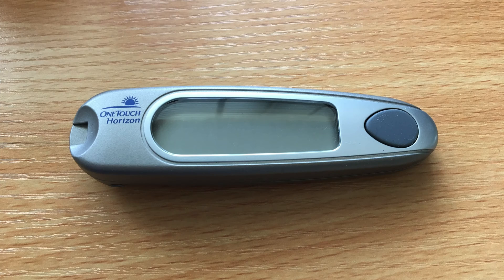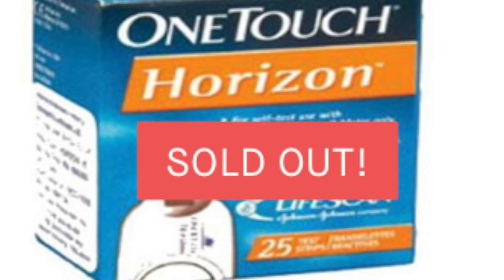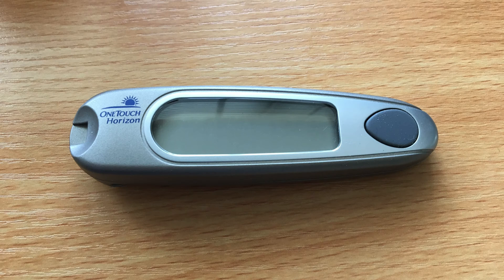I also have this one — a OneTouch Horizon from Thailand in 2011 — but I can't find any strips for it. I am currently accepting offers from museums with large budgets.